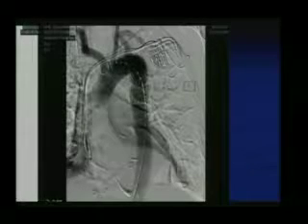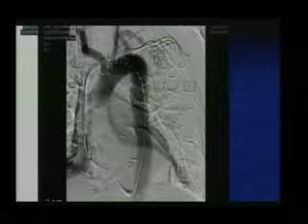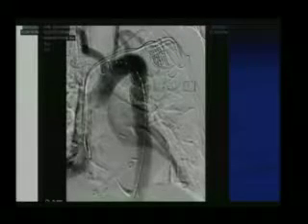And then the pacemaker was really in the way. This is an angiogram done at a very steep angle, but when we deployed to open up the arch, the pacemaker was right on the subclavian. So it was extremely difficult to evaluate where we were going to land the stent graft. We did use IVUS also to get the exact landmark.